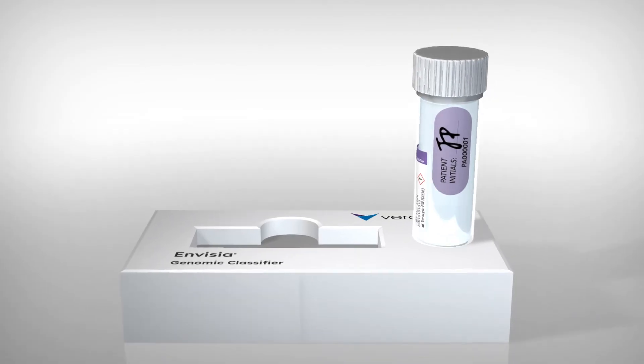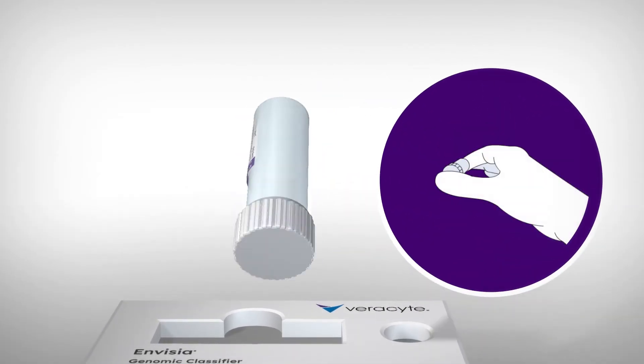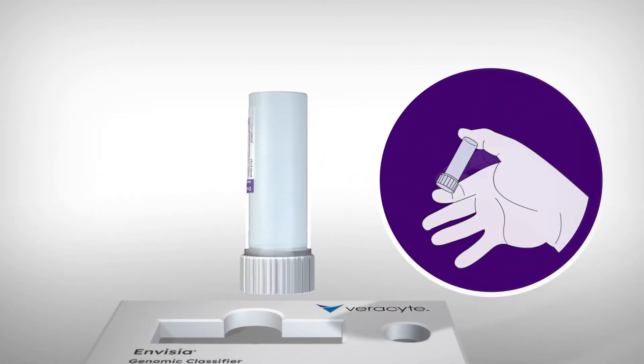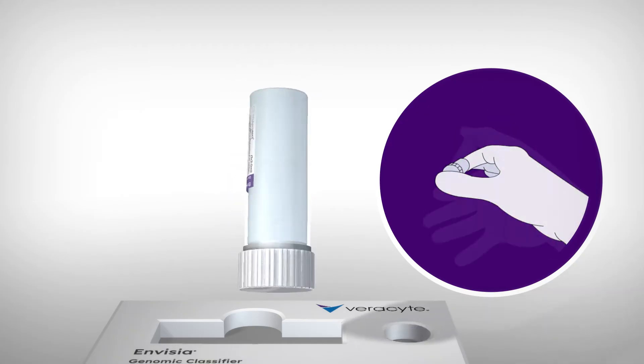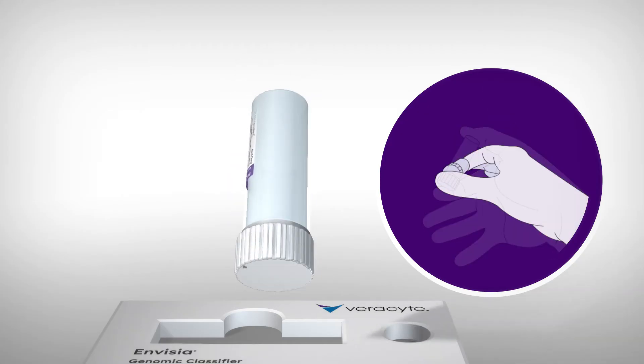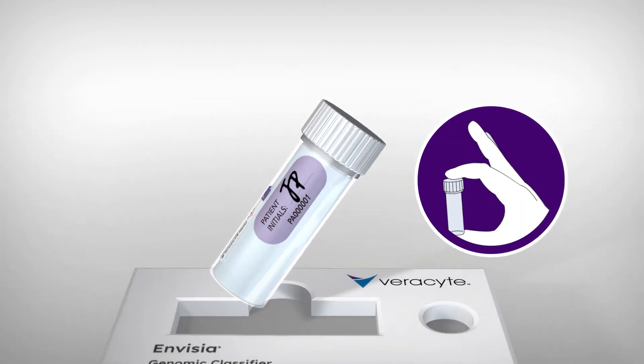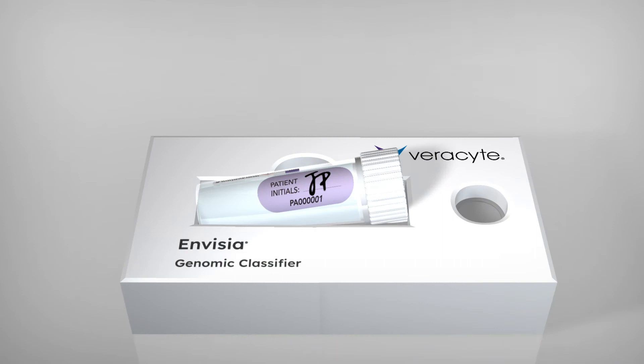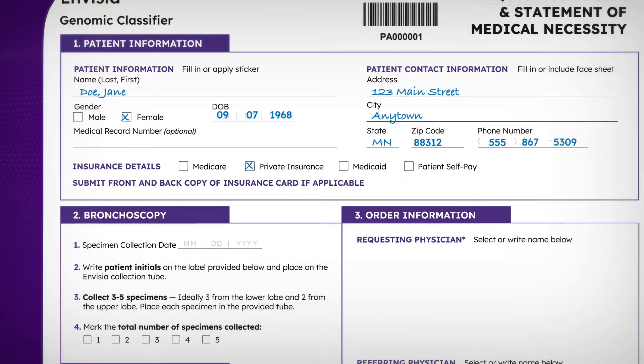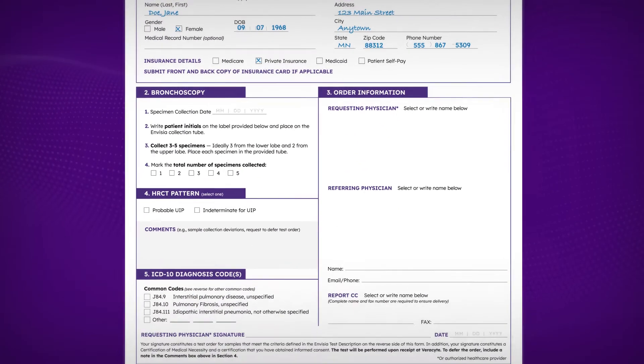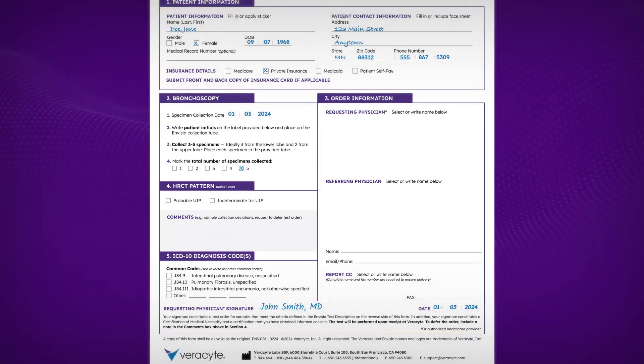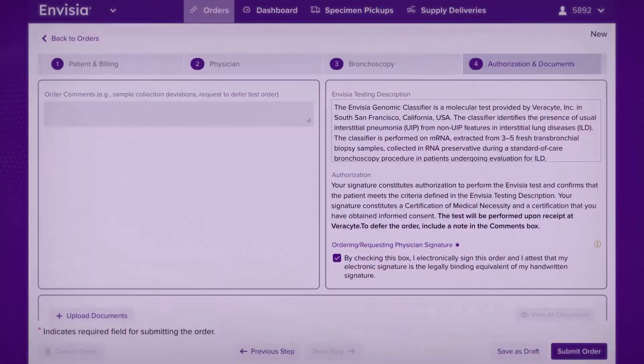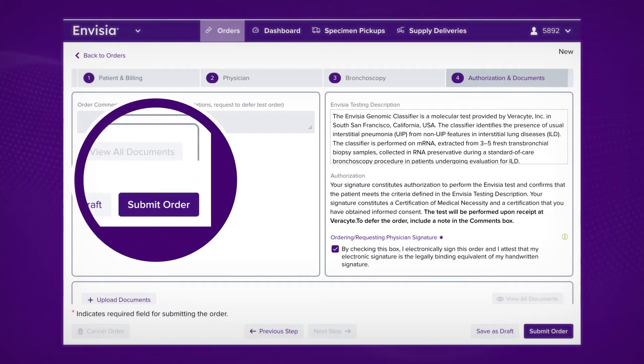Close the cap and invert the tube twice to suspend the specimen in the solution. Place the tube down in the cardboard holder. Mark the total number of specimens collected, and sign and date the test requisition form or submit the order via online portal.